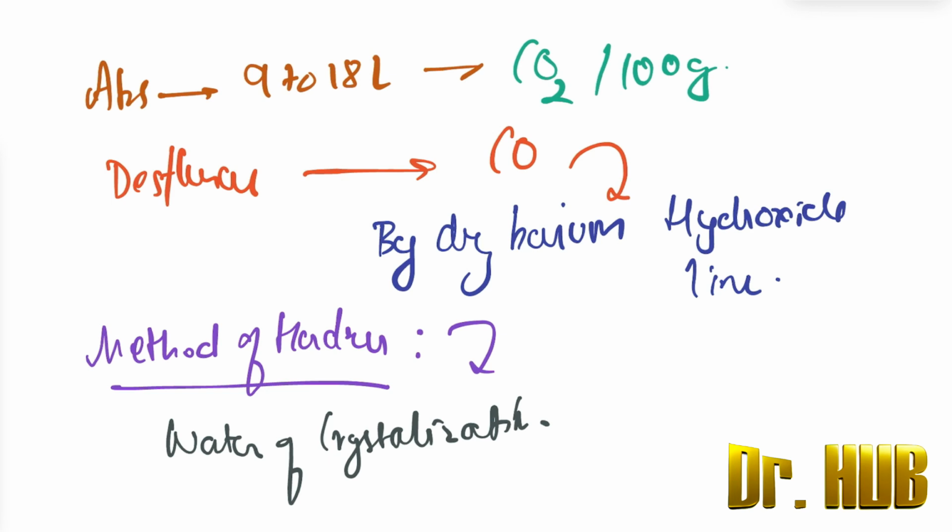So this was all about the composition of the carbon dioxide absorbers in the rebreathing system.